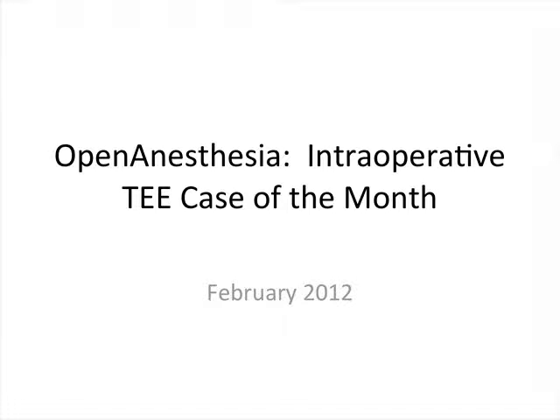This is Dr. Julie Huffmeyer with our Open Anesthesia intraoperative TEE case of the month for February 2012. Each month we feature an operative case which teaches or emphasizes an important aspect of basic intraoperative TEE.